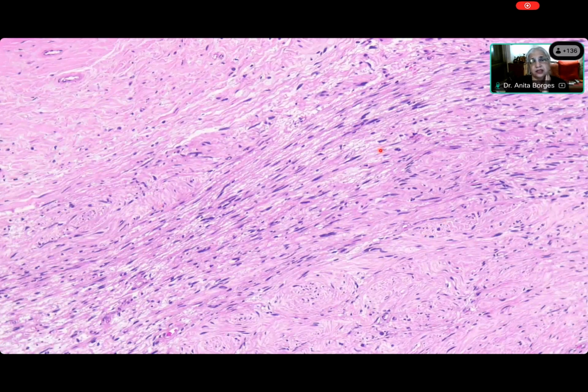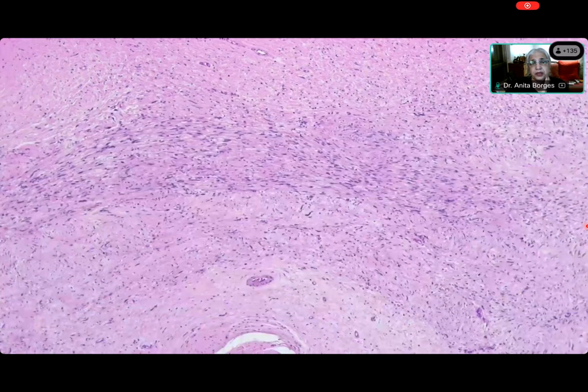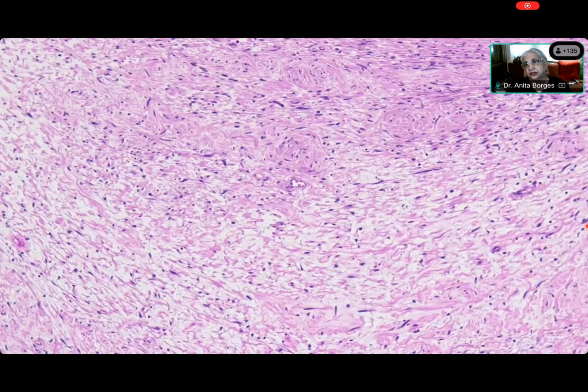No, yeah, it's a nice fascicle. But why are we calling it shredded carrot? Did you understand? You just read in the books and said shredded carrot. What is a carrot, Elsa? Wispy collagen. What is a carrot, Elsa? Ma'am, have you seen a vegetable carrot ever? Yes, ma'am. Yes, you have. What is it? It's a vegetable.